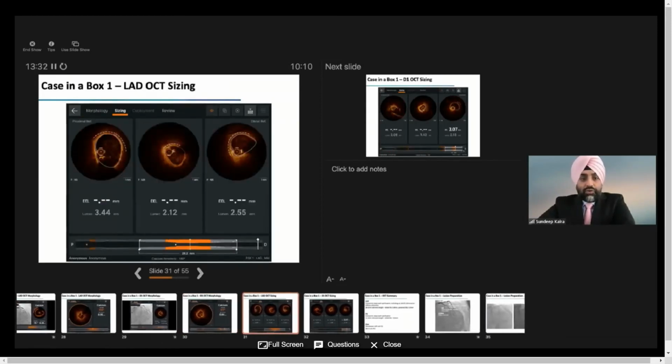The software also allows you to plan your stent length, so you can assess the lesion. We can see 3 panels here. On the left is where I set my proximal panel. We can see the dotted line for automatic EEL detection, so you're stenting to vessel size rather than just lumen. The panel on the right shows the distal reference that I've marked. I've got a 28 millimeter length lesion marked out here, and where we can see my marker in the middle is just the middle panel there.